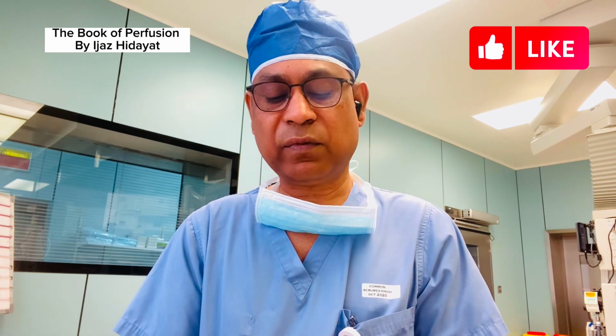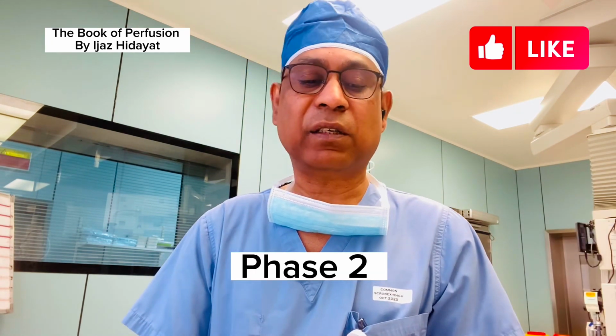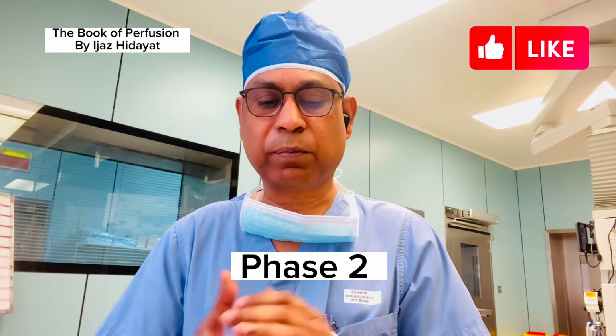In phase 2, once we decide that the patient will go on bypass, as perfusionists we prime our circuit as per the hospital protocol.